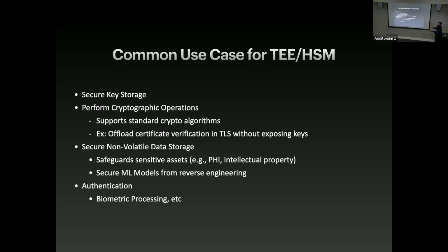And authentication. So if your device has to do some kind of authentication like Face ID or Touch ID, then you can offload that part to the TE. That's the other use case.